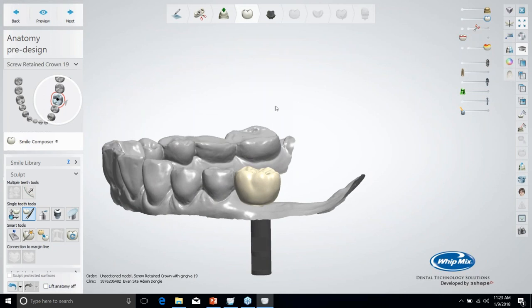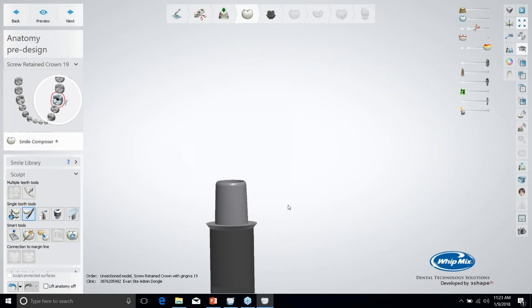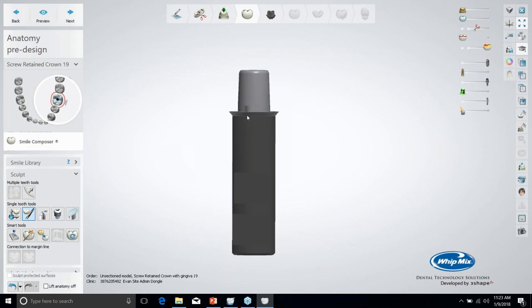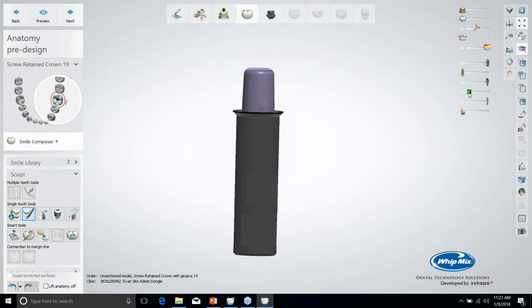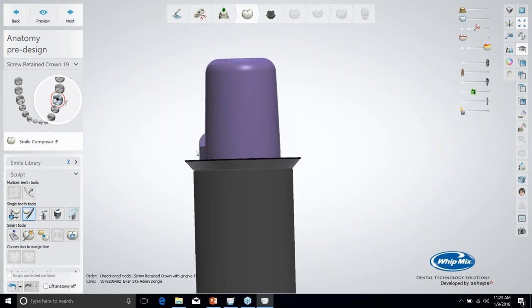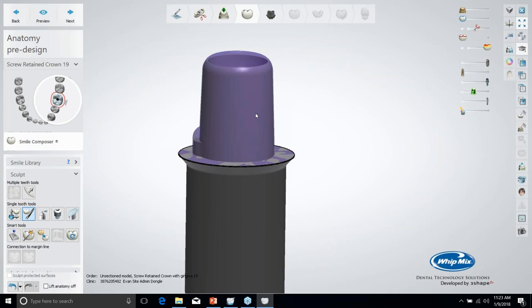So before I go on to the next part, I'm just going to hide the design and the scan and show you some of these library parts. So here is the tie base, which has an index, and where it would be positioned in regards to the analog. If I turn on this green slider right here, that's showing me what the internal contour of that ZR will be. So that's the surface it's actually going to cut to allow for cement space for the zirconia unit.